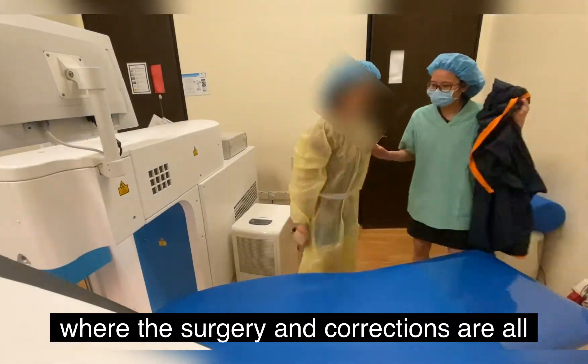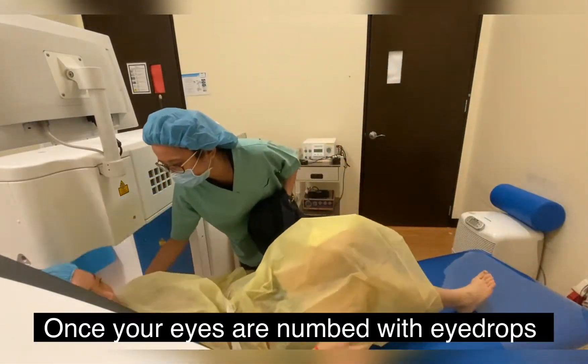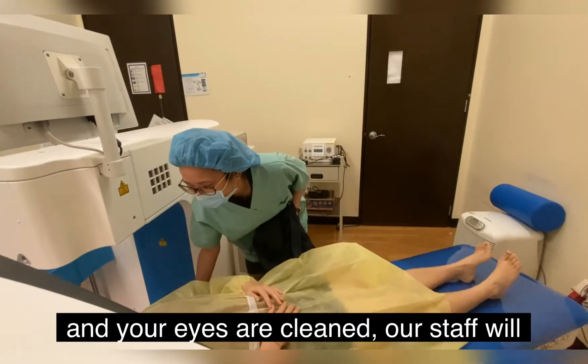In this video, you will actually see how the LASIK procedure is done on a real-life patient.